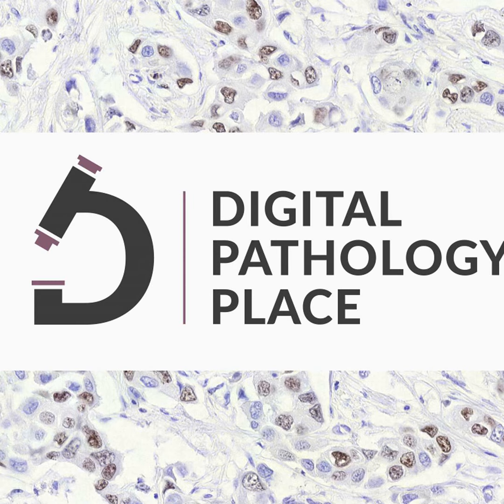The recent 2021 clearance of the prostate cancer decision support system created by the company Paige AI that uses AI-based image analysis is an example of the next transformation step. The system increases pathologists' efficiency by leveraging AI and image analysis to point out areas suspicious of malignancy to the reviewing pathologist. The validation studies of this decision support software showed that pathologists supported by this AI tool can diagnose prostate cancer faster and more accurately than pathologists without the AI tool or than the AI tool alone.